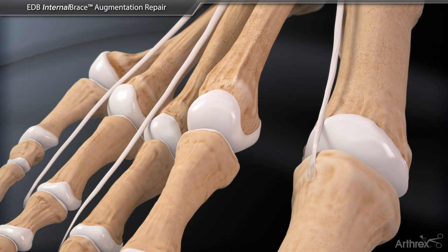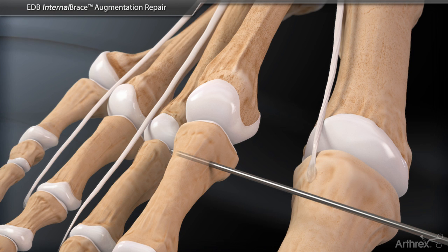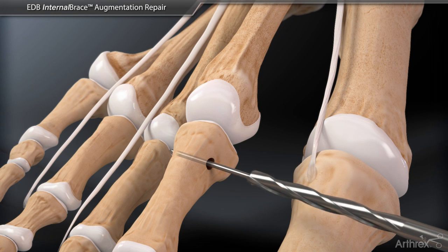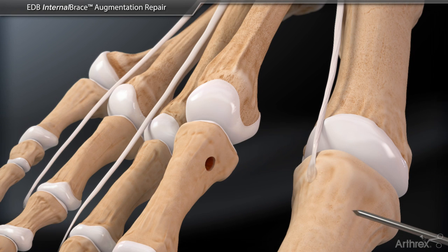Next, a guide wire is placed into the proximal phalanx from dorsal medial to plantar lateral. Using a cannulated 2.5 mm drill bit, drill through both cortices in the phalanx. Keeping the guide wire in place, a slight overdrill is performed using the 3.0 mm cannulated drill bit.